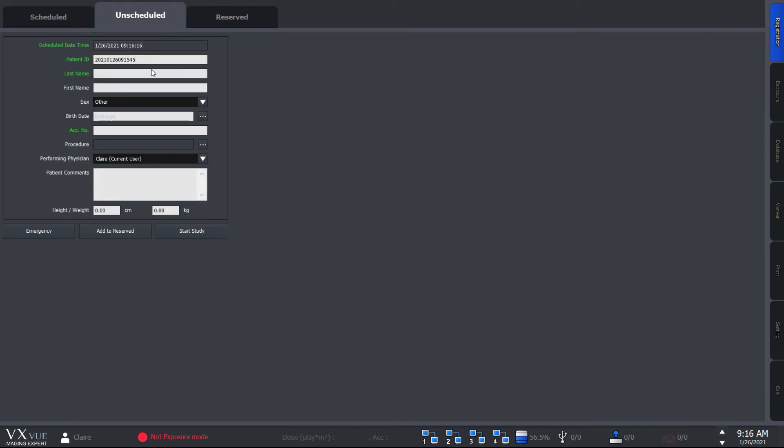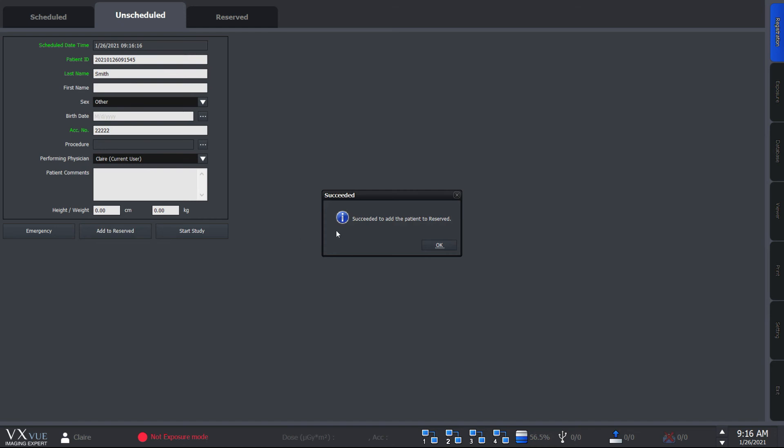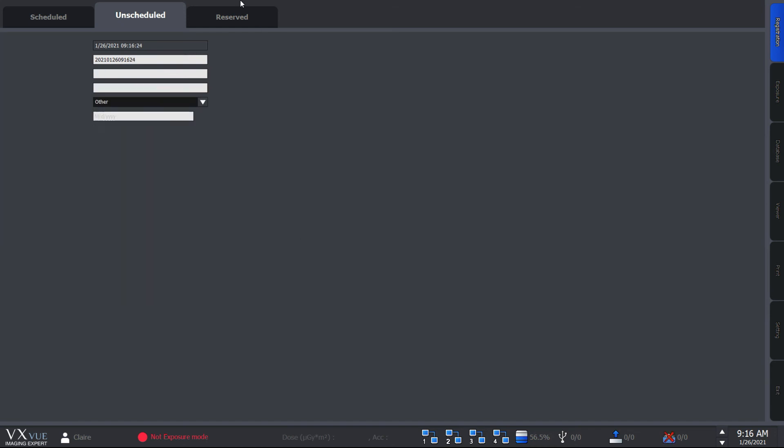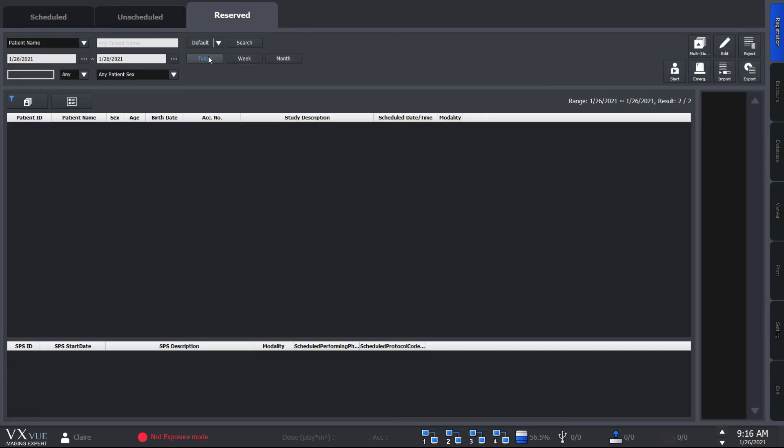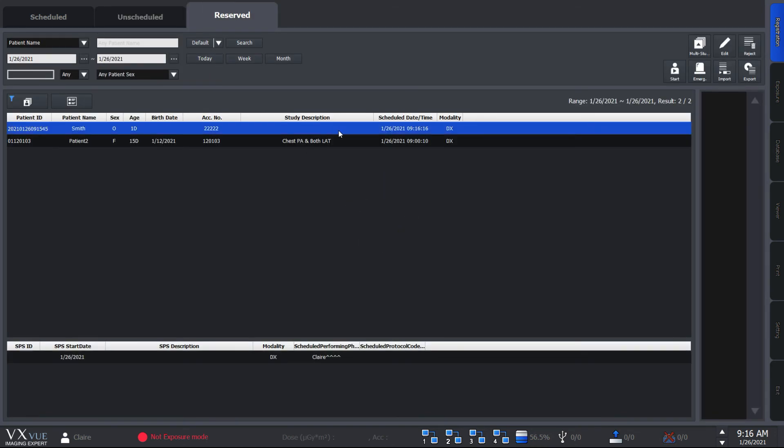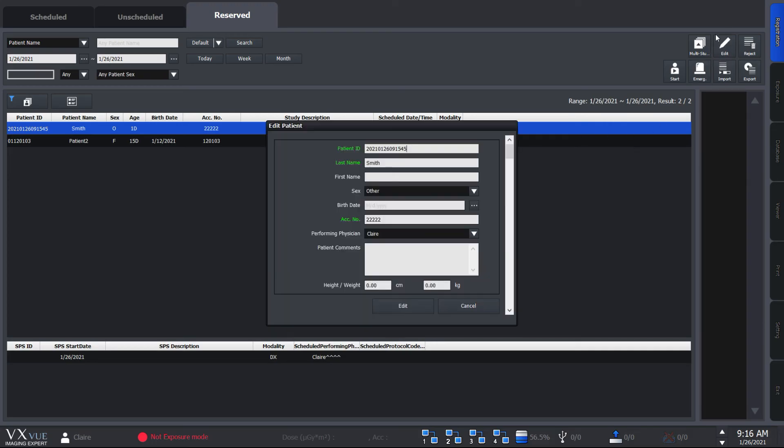Same thing goes for unscheduled. Fill in the necessary information and hit the add to reserve button. You'll see the patient information being listed under reserved. You can edit the patient information simply by clicking the edit button here.